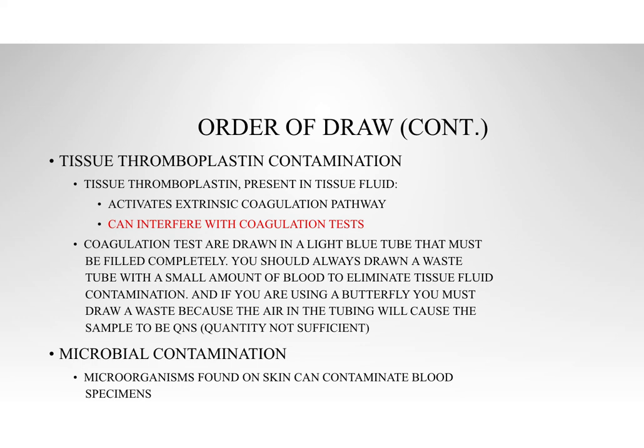Also, coagulation tests that are drawn in a light blue tube must be filled completely. The other part to that, we talked about that just a minute ago, is it should always be drawn with a waste tube that has a small amount of blood to eliminate tissue fluid contamination. If you're using a butterfly, you must use a waste tube so that the air in the tubing does not cause the sample to be quantity not sufficient.